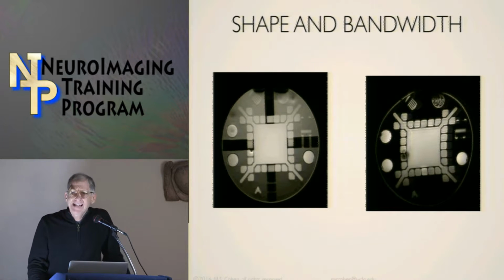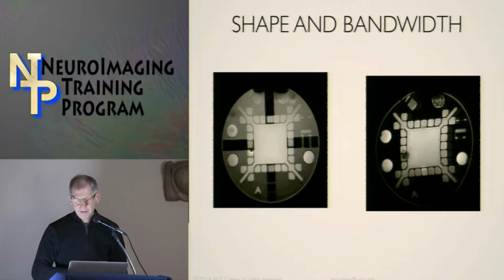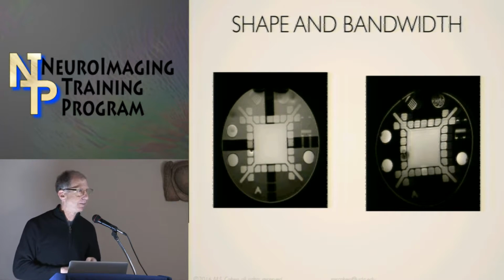Now, things magnetize to different degrees, not simply because of their chemical shift, but because different materials magnetize differently. And we have a factor known as magnetic susceptibility, which is the magnetizability, if you will, of a sample.